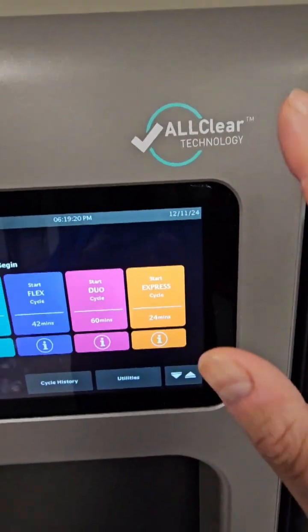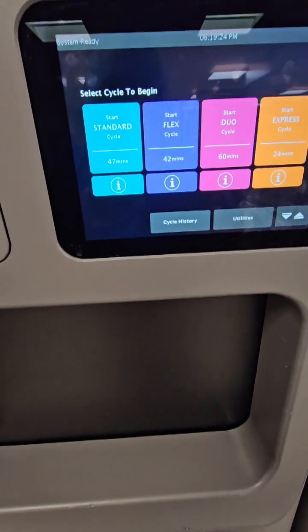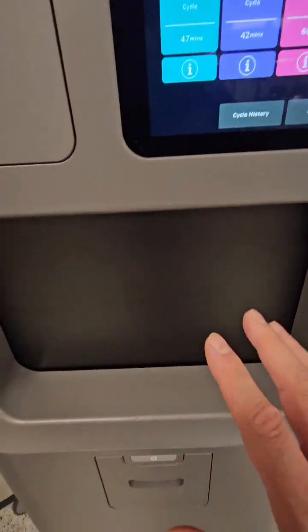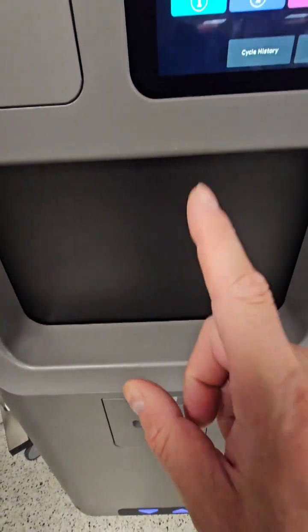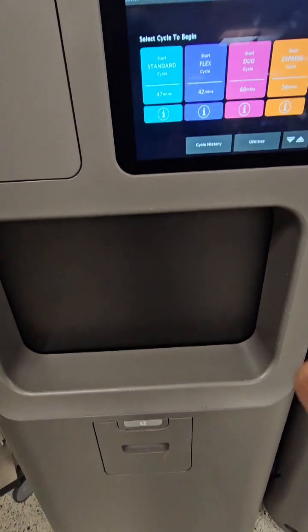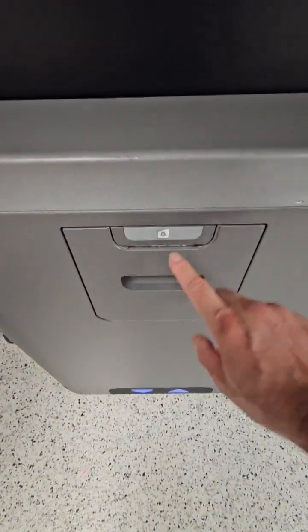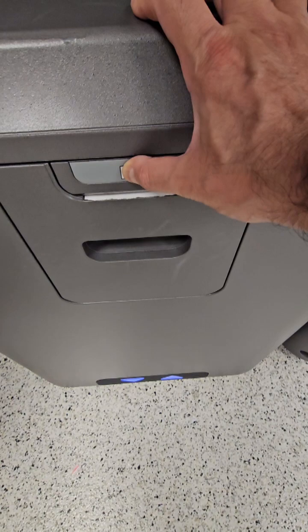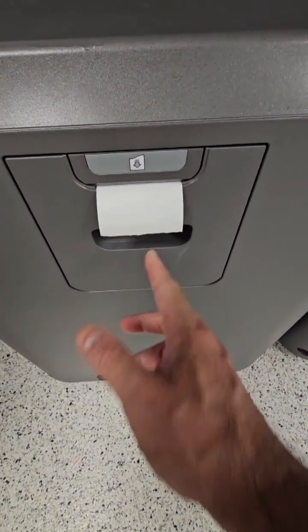A tip I give everyone: do your own preconditioning before you hit that start button. Place your items in the load, wait about 5 to 10 minutes before you hit start, and let the all-clear technology do another official preconditioning phase. You'll thank me later — there's a rhyme and reason for doing it.